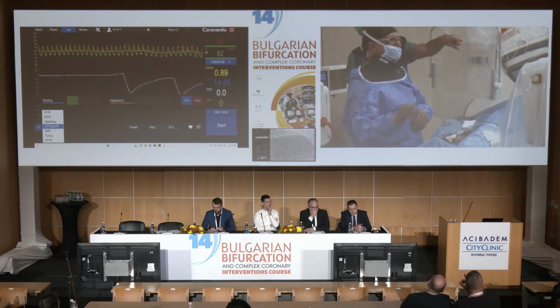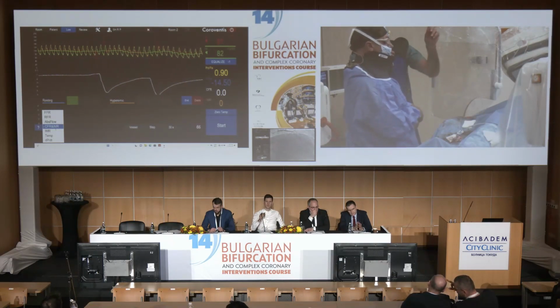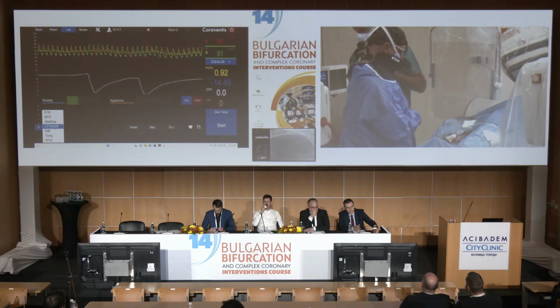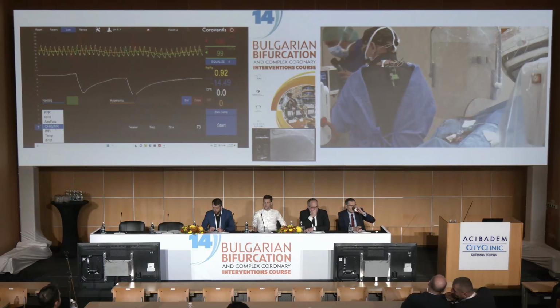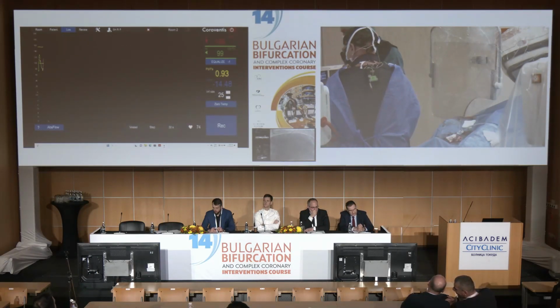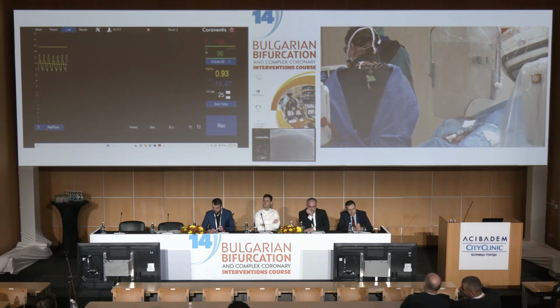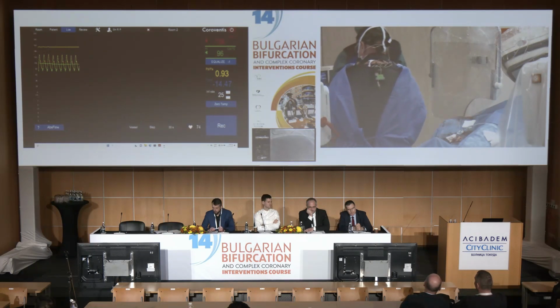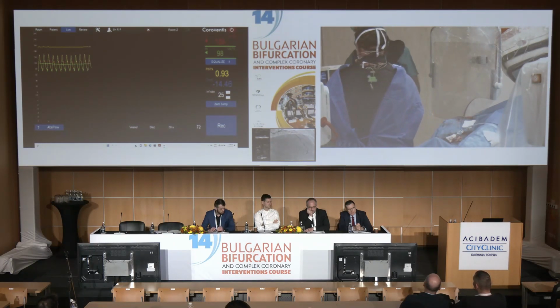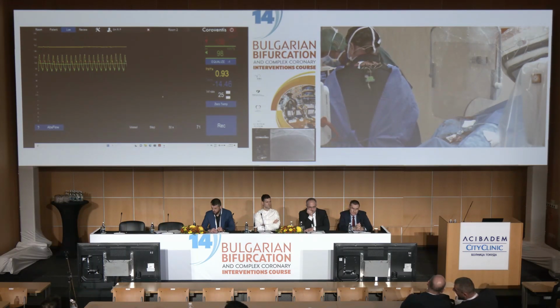We have the sensor of the wire which is in the distal part, and the saline will be given in the proximal part of the LAD. Now, on our side, we have to go to the capability of the system to measure absolute flow. It's written absolute flow, so it's available on all the Corventis. That's not a special license, it is available. Okay? We also, and that's very important, have to zero the temperature.